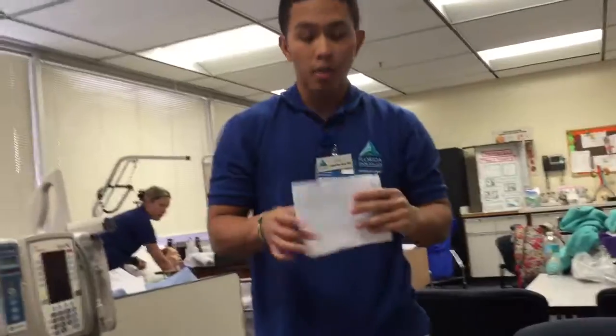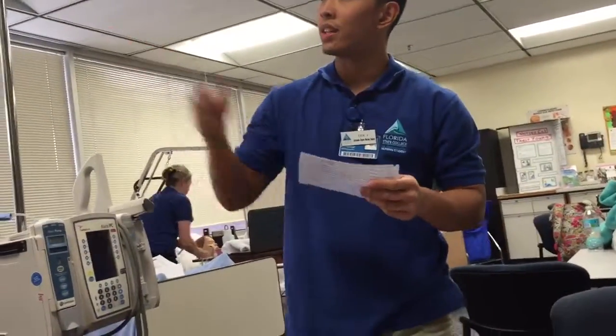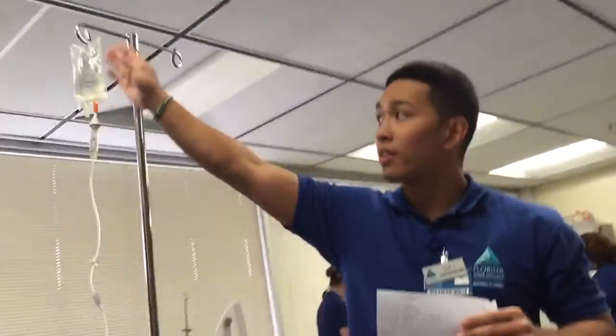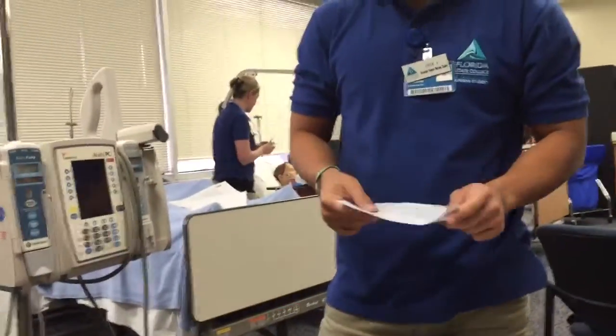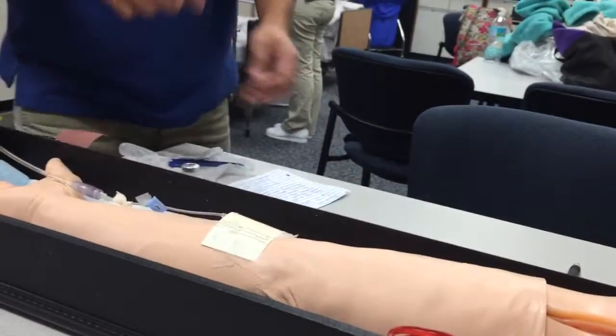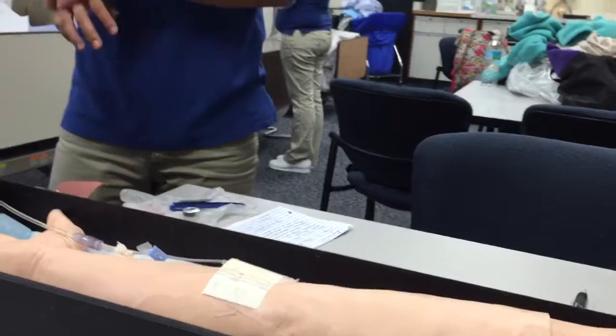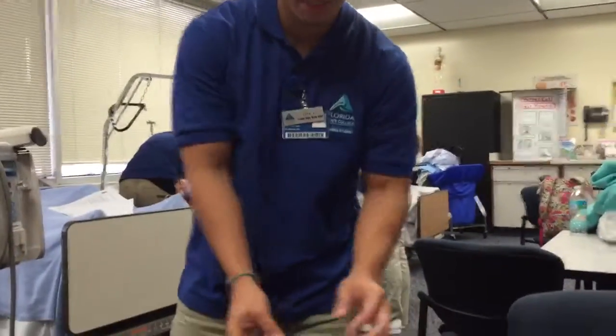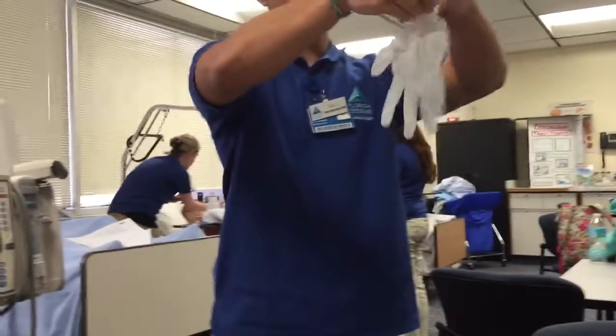And we're gonna be hanging a mini bag today via the IV. You already have normal saline running, so we're gonna go ahead and just connect it to that. I'm gonna go ahead and inspect your IV site right there. I'm gonna go ahead and perform my hand hygiene first before I actually touch him. I'm just pushing the tape down. I'm gonna wash my hands, apply my gloves.